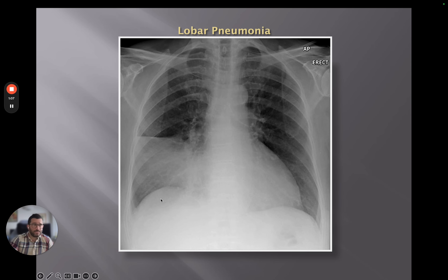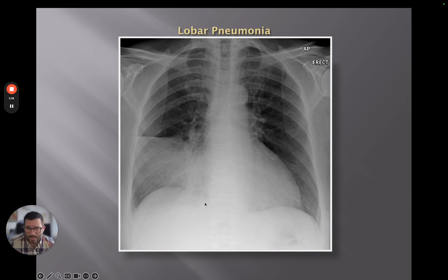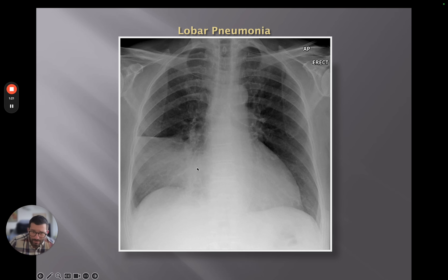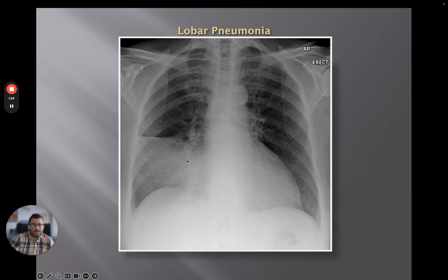Similarly, this here is in the middle lobe because it sits inferiorly and doesn't cross the minor fissure. We can still see some right heart border here — very difficult to see — so because we're obscuring that, we know this is in the right middle lobe.